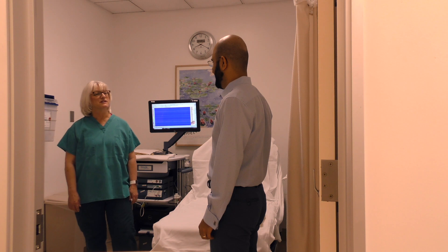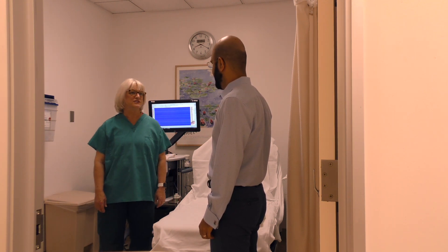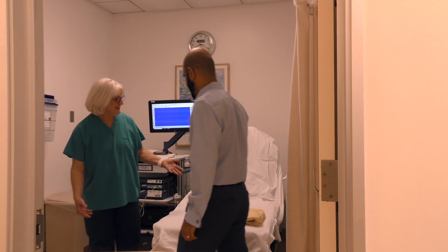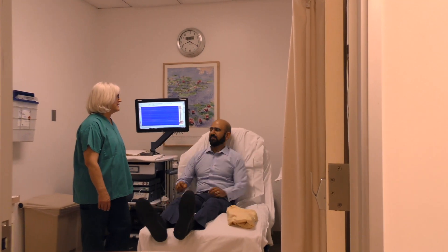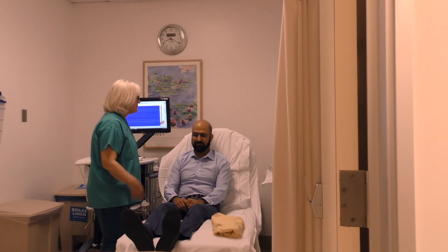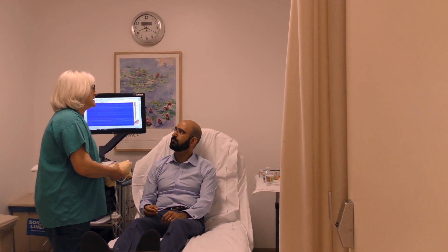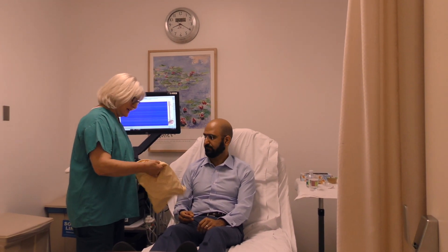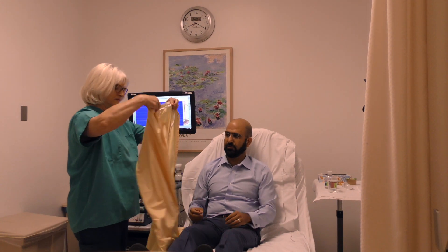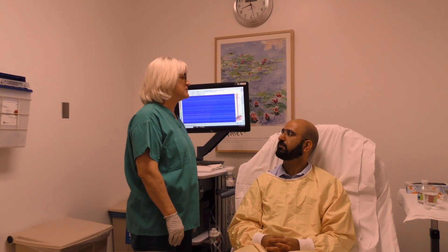Good morning, Mr. Rizzai. My name is Vicki. I'm one of the registered nurses in the unit, and I'm here to help you with your esophageal manometry procedure today. I'll have you put your feet up here on the stretcher, and I will give you a gown to put on over your clothes. Have you followed the instructions of not eating or drinking after midnight? Yes, my last meal was last night at 7:30 p.m. Here is the gown — it will protect your clothes.